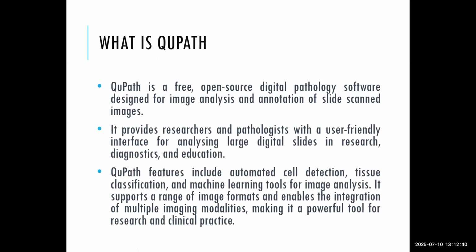It's mainly used for slide scanned images, and we'll go into what that is and why we would do it shortly. It provides researchers and pathologists with a user-friendly interface for analyzing large digital slides. User-friendly software is very important, because if it's too hard, then a lot of people just completely avoid it. But QuPath has been designed to be very user-friendly.